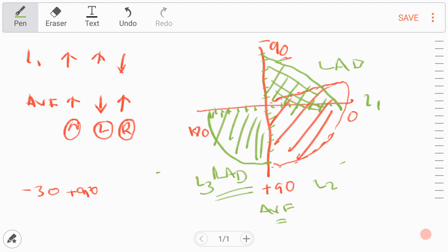One small square on the ECG paper equals 0.04 seconds. This is because the speed of the ECG paper is 25 millimeters per second, so 1 divided by 25 equals 0.04. Thank you so much for watching this video, take care.